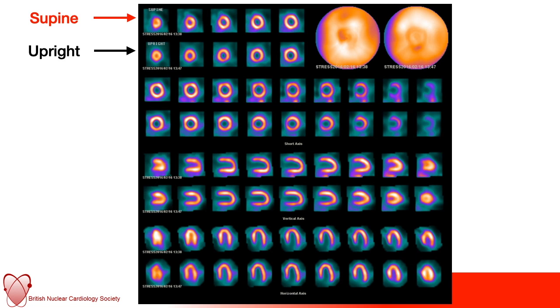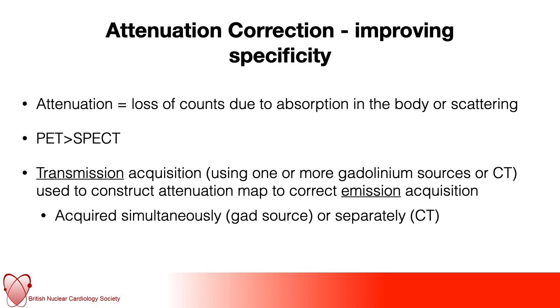The other thing we can do is reposition the patient. Here the top row shows the supine position and the bottom row the upright position, with short axis images running apex to base left to right, followed by vertical and horizontal long axis views. There is a subtle reduction in counts in the basal and mid anterior wall clearly visible on the left-hand bullseye in the supine position, but once the patient is moved upright that disappears entirely. By definition this is attenuation — likely breast attenuation in this lady — which has resolved with the upright position. Attenuation correction using a transmission acquisition — either from an external gadolinium source or CT — constructs an attenuation map to correct the emission acquisition and does improve specificity.